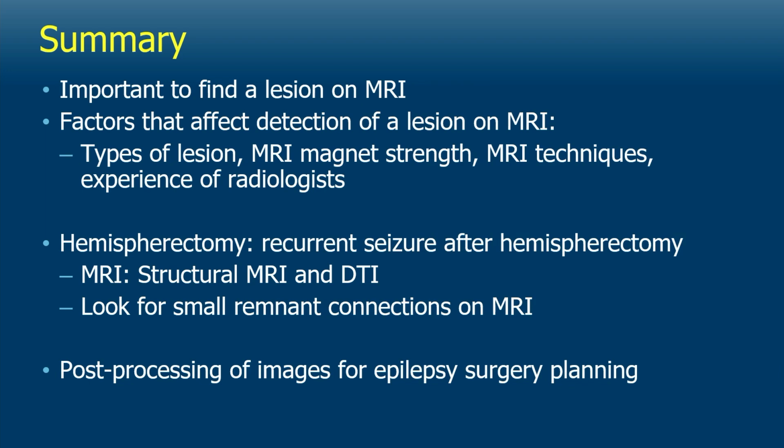In this lecture, we then reviewed hemispherectomy, and what happens if the child develops recurrent seizures after hemispherectomy. So typically we'll do high-resolution structural MRI and diffusion tensor imaging, and we look for small residual connections that connect the two sides of the brain.